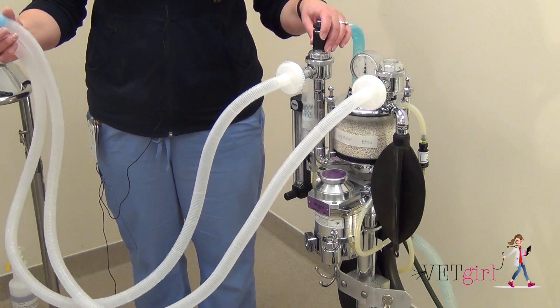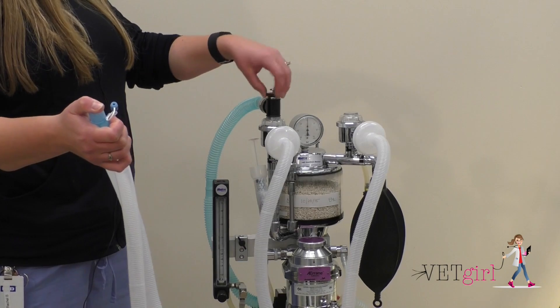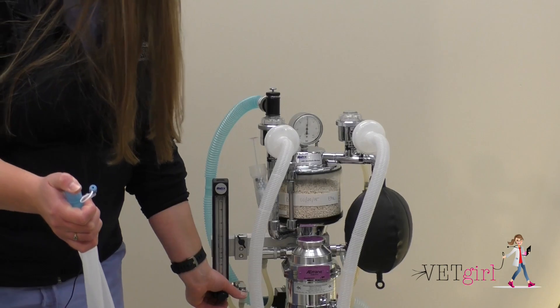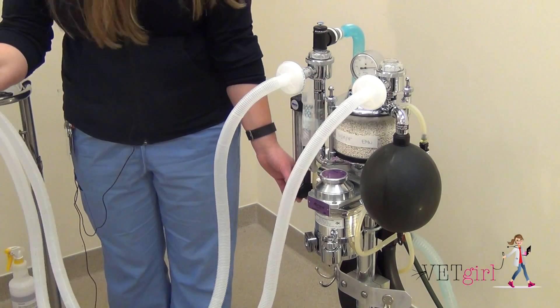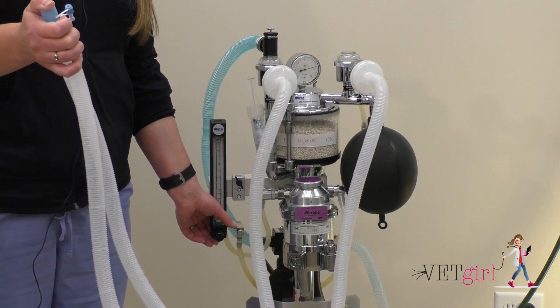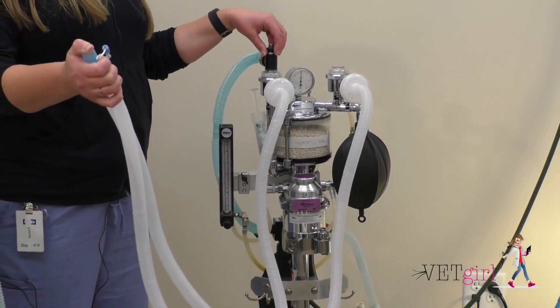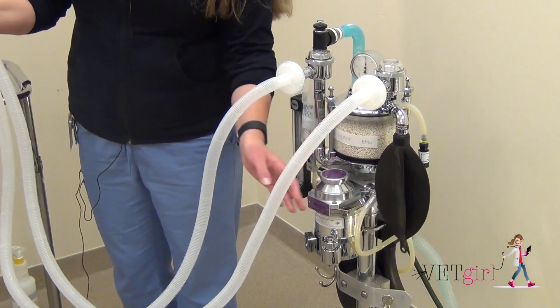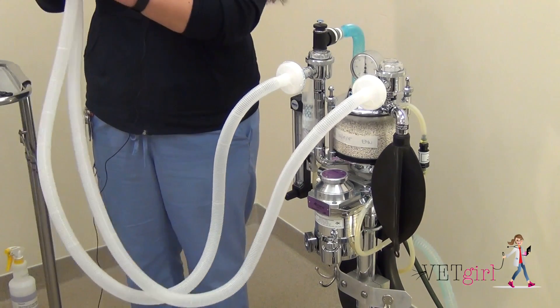To perform a leak test with this system, simply cover the end of the tubing that will be connected to your patient. Close your pop-off valve and apply pressure using your oxygen flush valve to your reservoir bag until you're at about 30-plus centimeters of water in your system, and watch your manometer for a few seconds to make sure it's holding pressure. Once you confirm that your system is not leaking, open your pop-off valve, let the pressure and waste anesthetic gas release back out your scavenge. It's always good practice to squeeze your reservoir bag to flush any residual waste anesthetic gas out as well. And then you're all set up for your re-breathing system, also known in this case as the Y-piece.